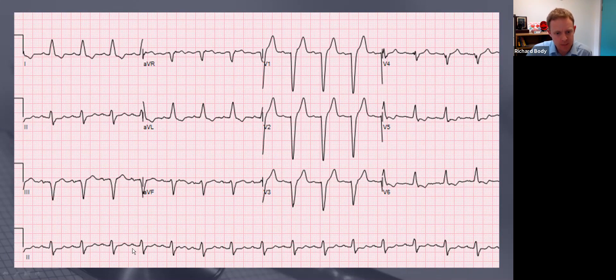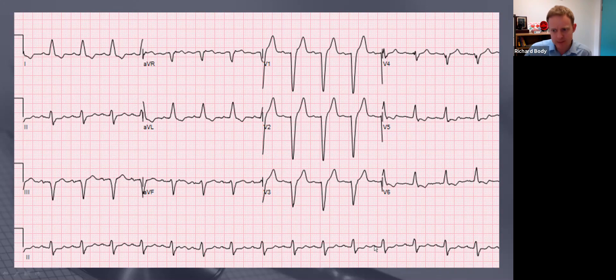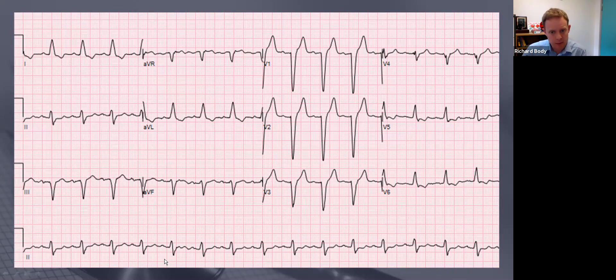P wave, QRS complex, T wave - normal sinus rhythm. The PR interval is just at the upper limit of normal at about five small squares, but just creeps in under that, so I think it's not first degree heart block - it's sinus rhythm.